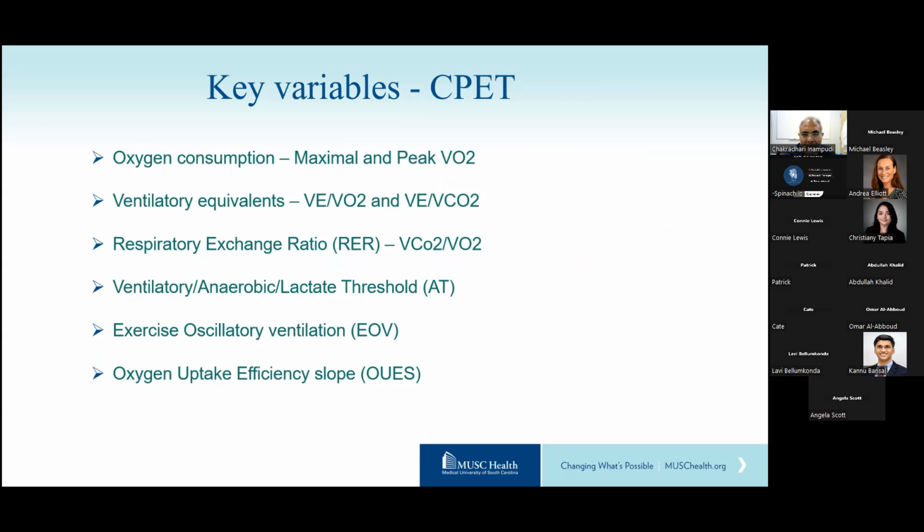We measure the maximum and the peak VO2. We measure the ventilatory equivalents, which are the VE-VO2 and the VE-VCO2. We also measure the respiratory exchange ratio, the ventilatory anaerobic or lactate threshold. We measure the exercise oscillatory ventilation and the oxygen uptake efficiency slope.